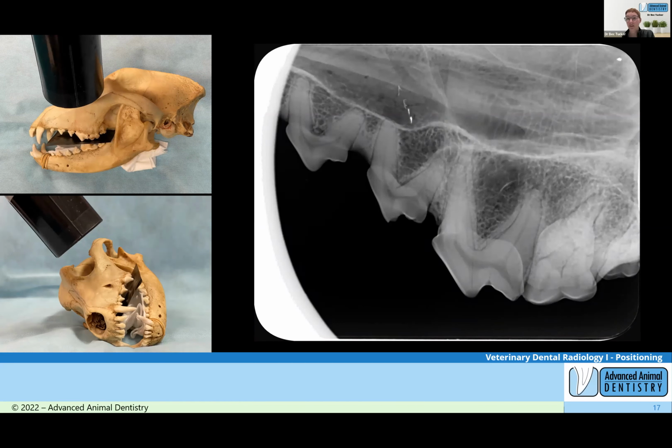So we perform our dentals in lateral recumbency. I know there are people that do it in dorsal. For us, we don't roll the patient. If we've got them in left lateral recumbency, we'll take all of the images of the right-hand side without rolling them. We will move and manipulate their head around to get the generator into the right position. By doing that, you're not irritating your nurses by rolling them too many times and getting all the leads caught under them and twisted. It's also possibly a bit safer for the patient. If you're rolling them less, there's less risk of things like regurgitation.